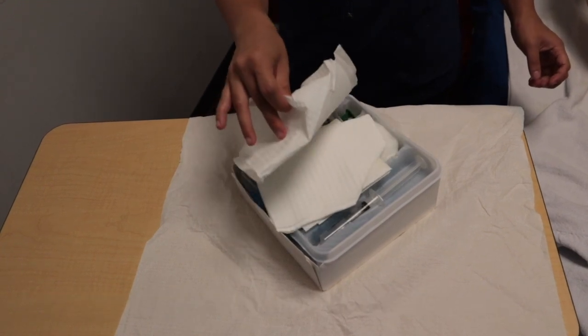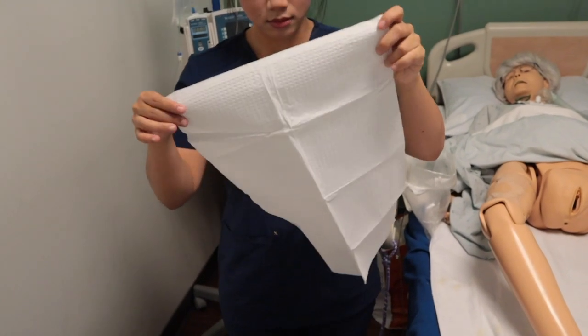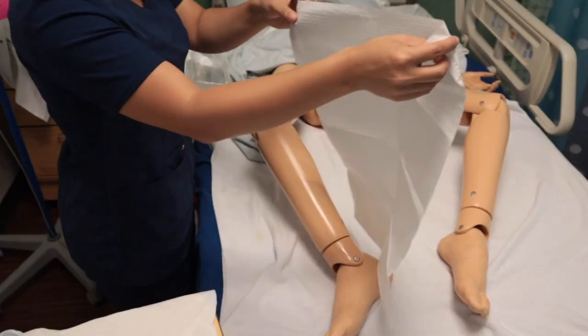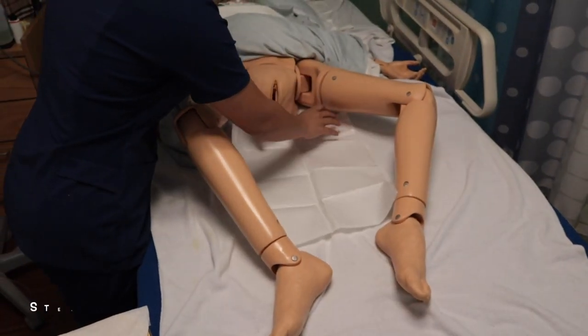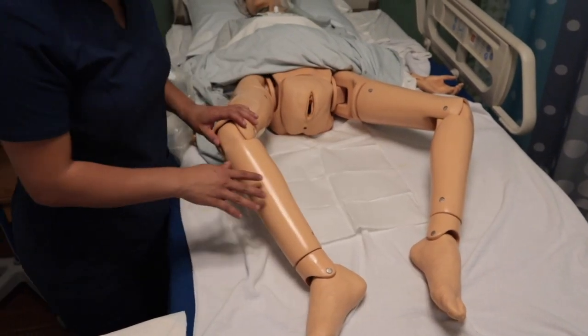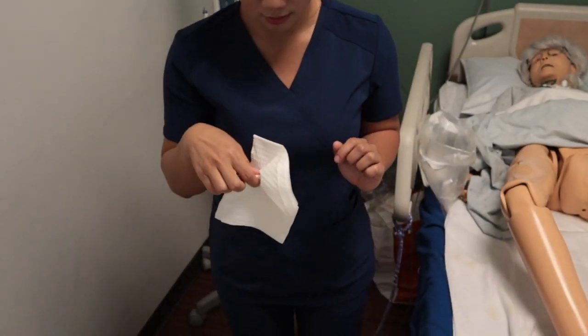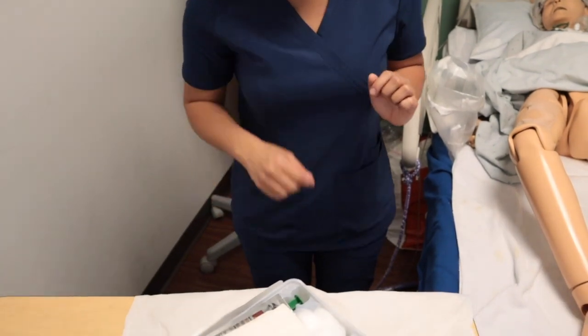Grab the square drape from the top and not the sides. Step back and open it away from your sterile field. Drape it behind the patient's legs, still ensuring the sterile field is in your line of vision. There is a diamond-shaped drape that you can put over the patient's peri area. I personally don't like using it, so bye!